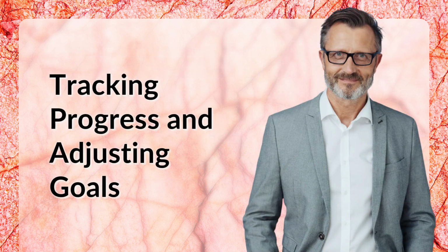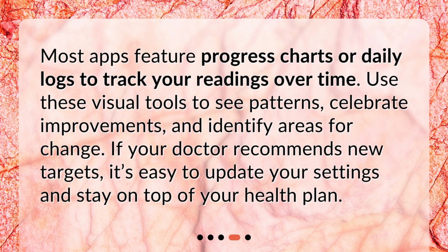Tracking progress and adjusting goals. Most apps feature progress charts or daily logs to track your readings over time. Use these visual tools to see patterns, celebrate improvements, and identify areas for change. If your doctor recommends new targets, it's easy to update your settings and stay on top of your health plan.